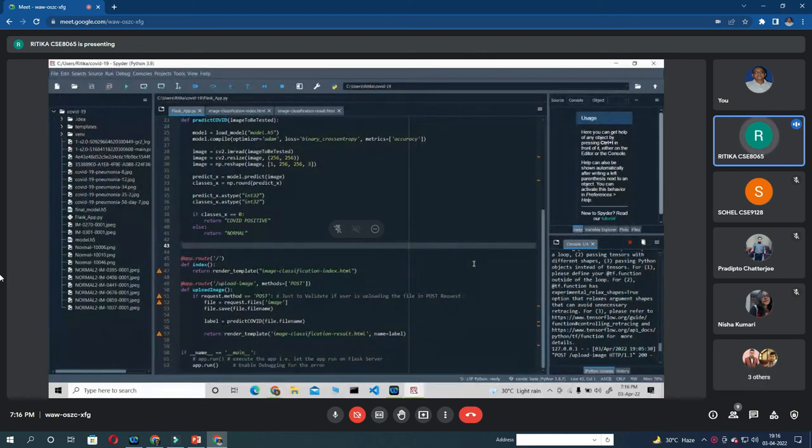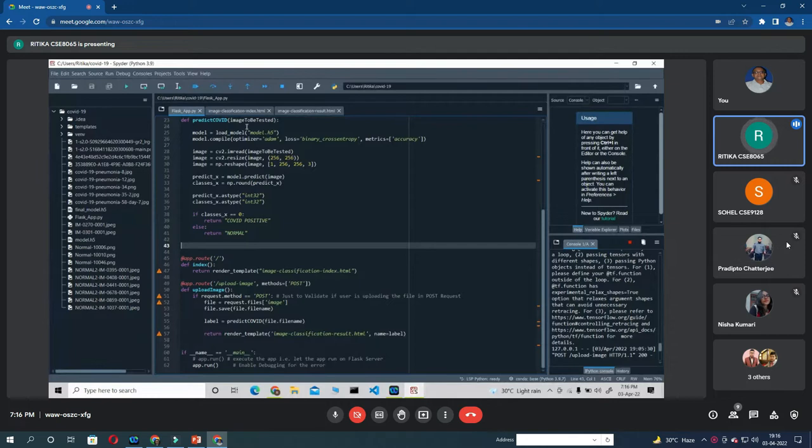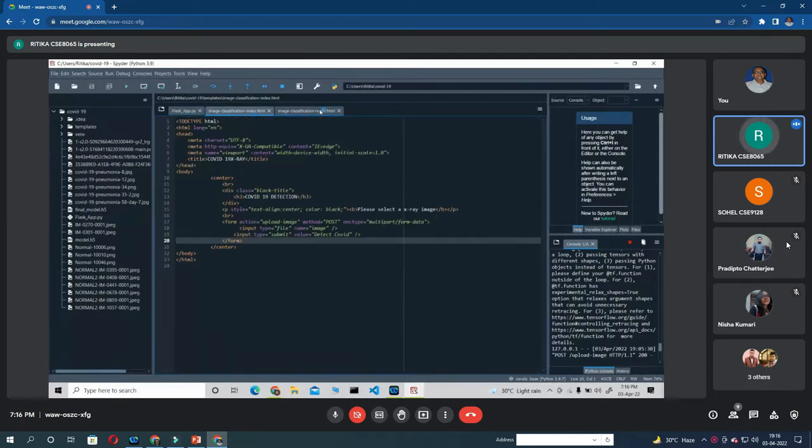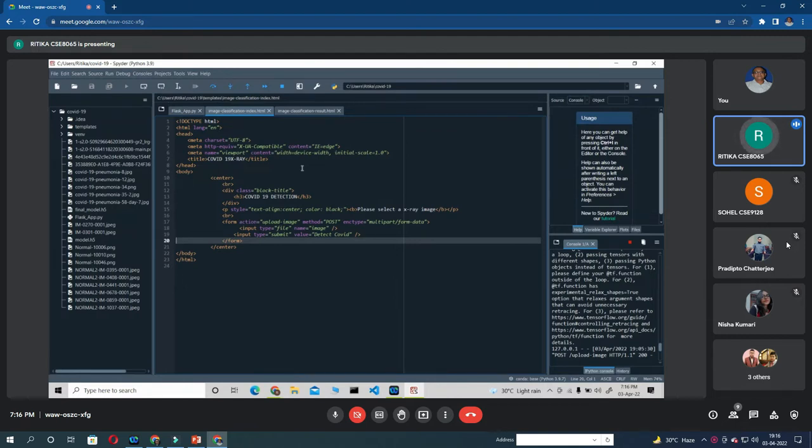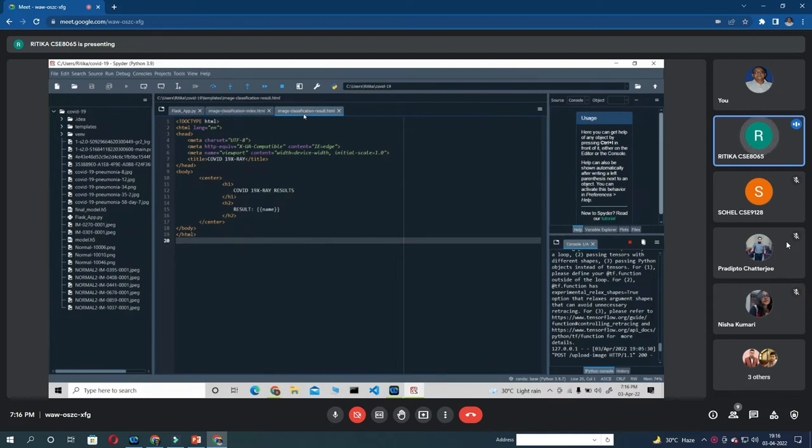So basically I have developed the Flask app. Here I have used two HTML templates. The first one is used for selecting the image and uploading it to verify whether the chest x-ray is of a COVID positive person or of a normal person. The second template is simply used for displaying the result.